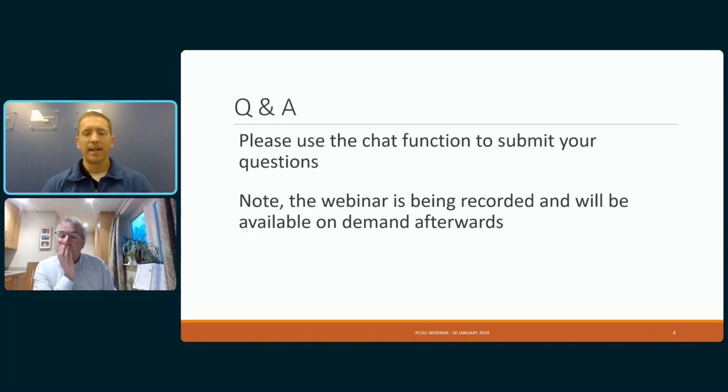So, for example, any type of ester drug, I do not feel would be very suitable for this collection, because you're going to need to reduce the pH, add some type of antioxidant, things like that. Although the drying might help, I don't think it would completely inhibit it to the point where it could meet validation criteria. So being able to take some type of stabilizer that might be coated in a tube, like a sodium citrate, and instead coat it on the actual cartridge.